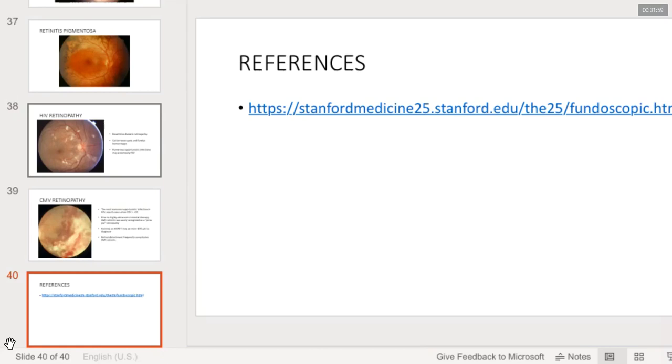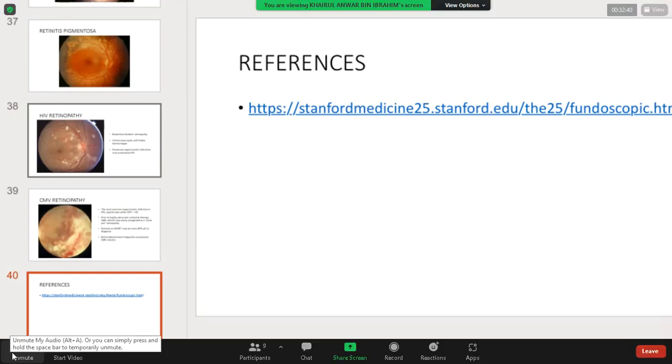But if we are just talking about cup disc ratio, basically the normal would be less than 0.3. Okay? But if the cup disc ratio is about 0.5 and above, it is suspicious of optic neuropathy, which most of the time would be glaucoma. And if we are talking about 0.8, 0.9, 0.95 or complete cupping, that is basically optic neuropathy. But if it's 0.5, it is a bit suspicious. So that is when we do a serial assessment to really determine whether this is a normal optic disc or an abnormal optic disc.